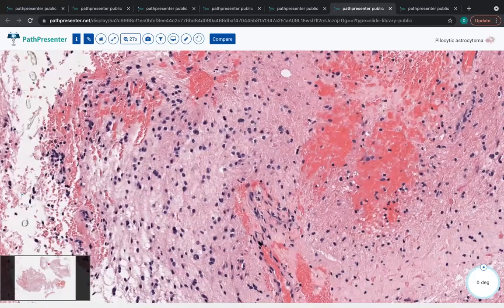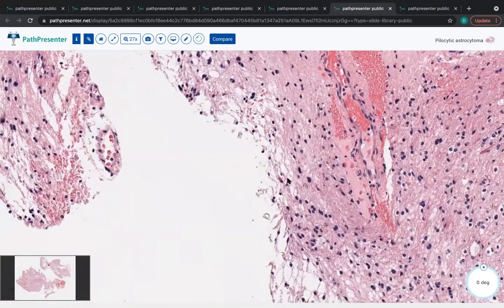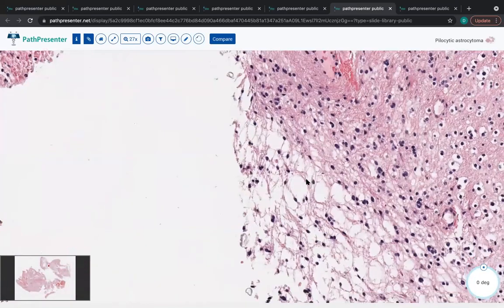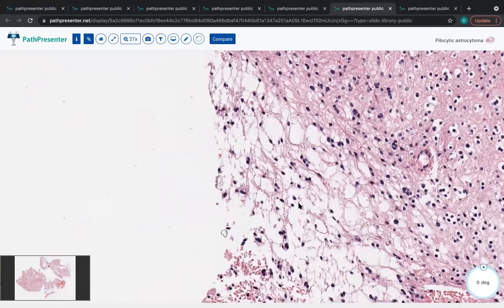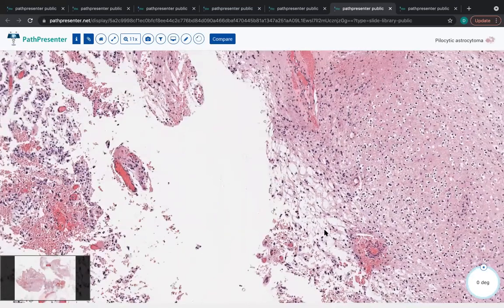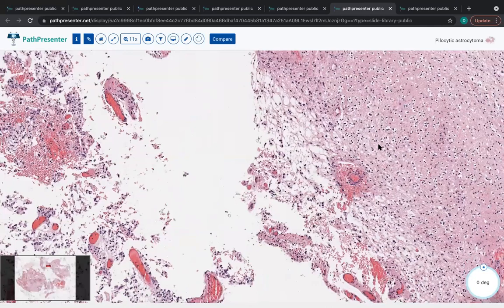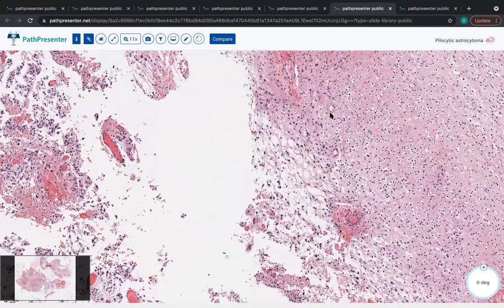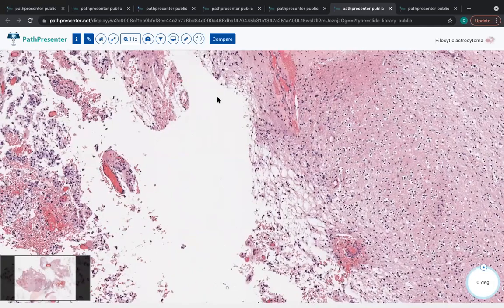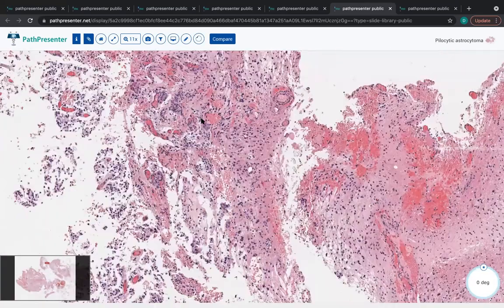One can even use the term glioma with piloid features, which is something that we use fairly routinely, even in permanent section diagnoses. If we have a tumor that shows many of these features, such as pilocytic type morphology to the tumor cells, and maybe some Rosenthal fibers, and maybe some unusual vessels.